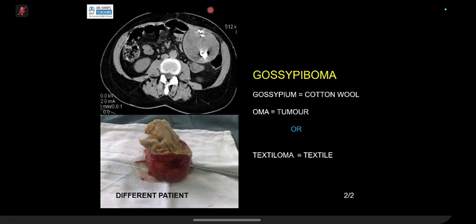Because radiologically speaking, of course, if the patient presents with an acute abscess, you will see rim enhancement, and the clinical features will be there. The key point is the concept of barium-impregnated cotton wool. Barium is a very high density material. If you do a CT with barium, you will get artifacts. Why are these artifacts there?